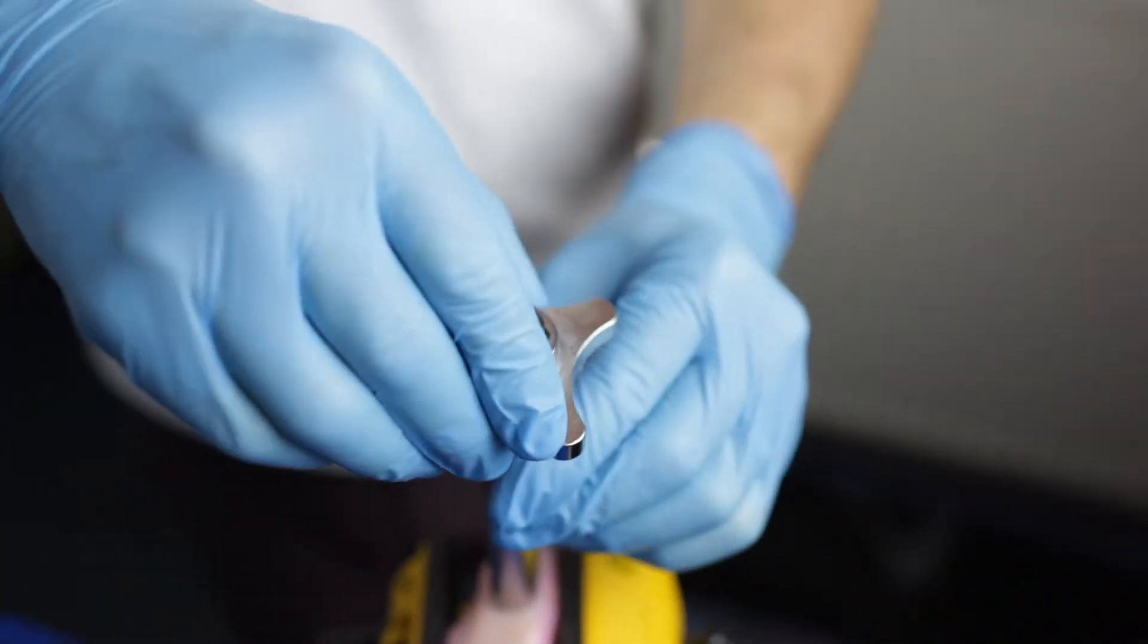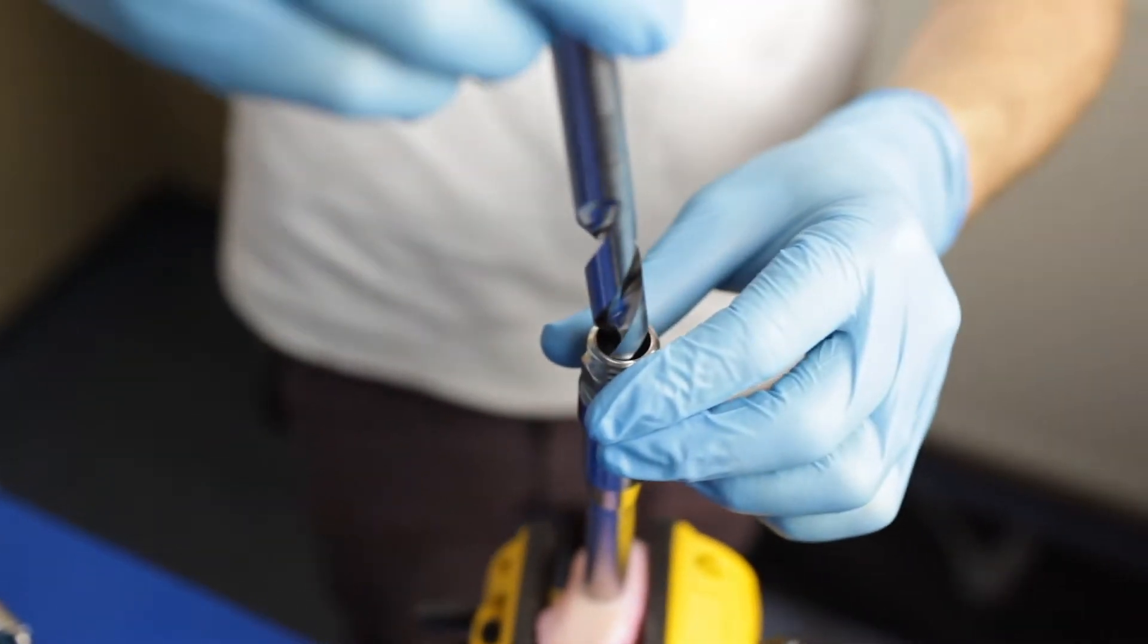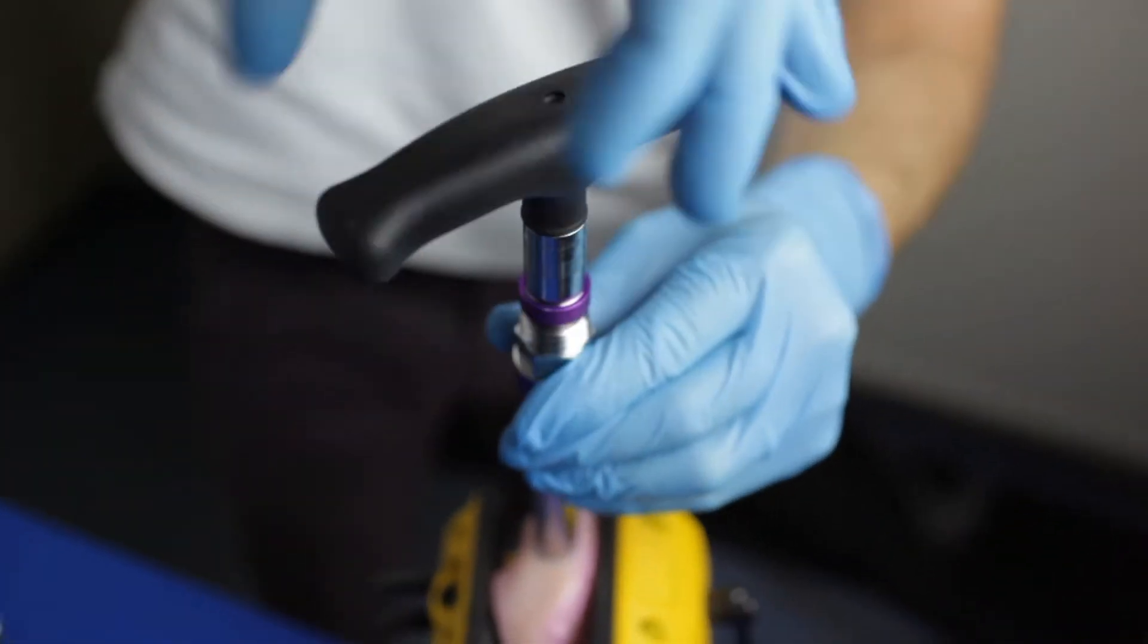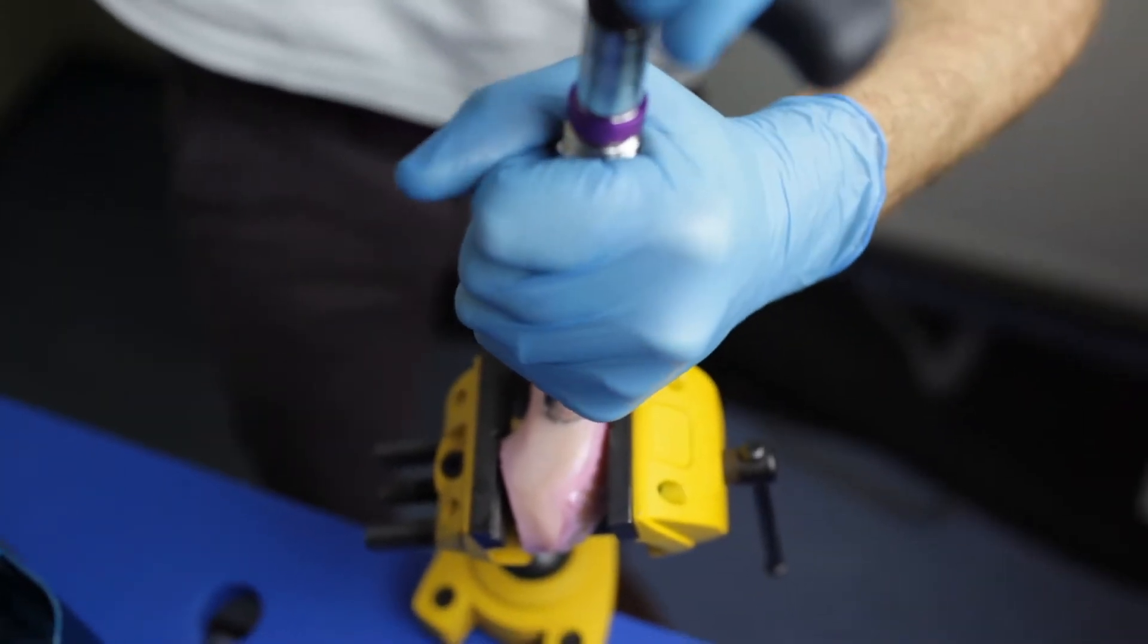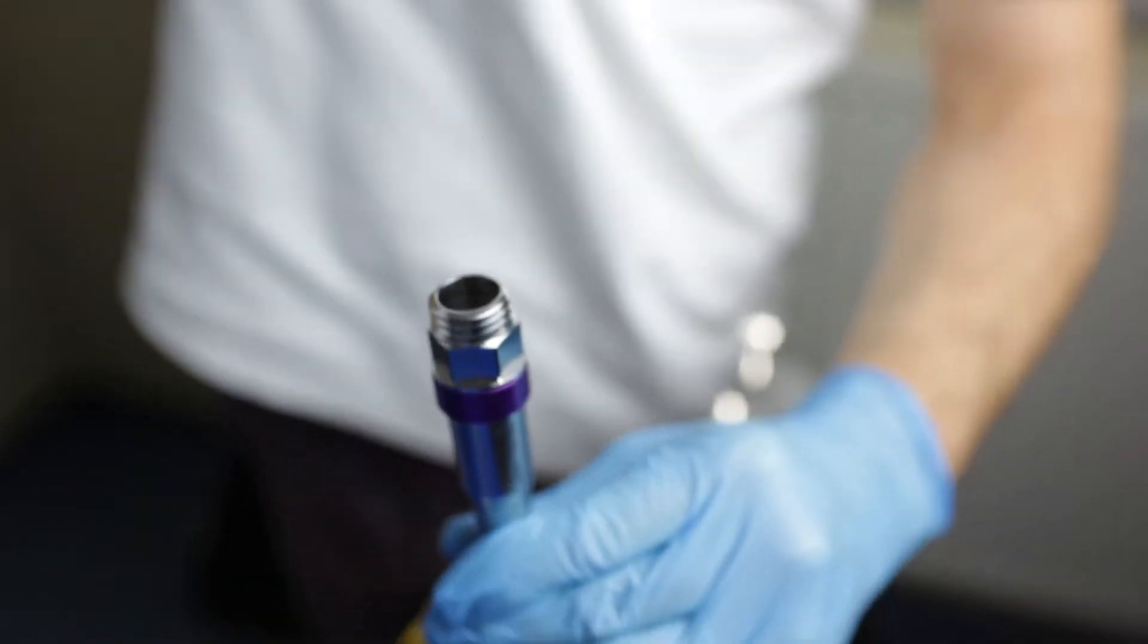Once you're at the desired level, you can either leave these pieces on for stability or take them off. With a T-handle, take the corresponding reamer which automatically stops when it reaches its full depth, which is flush with the original cutter.